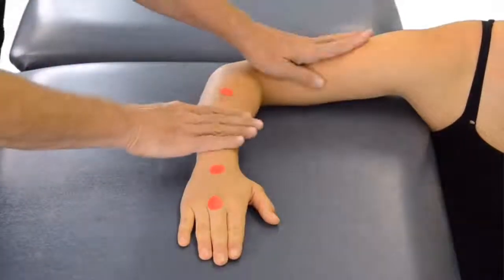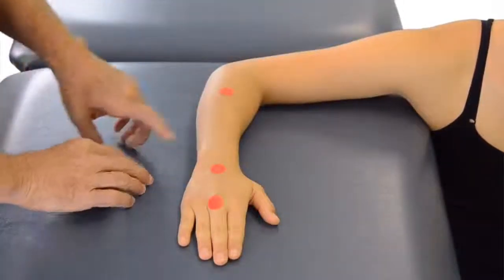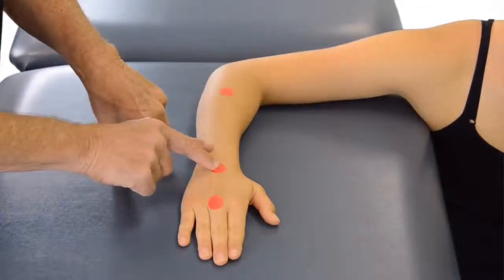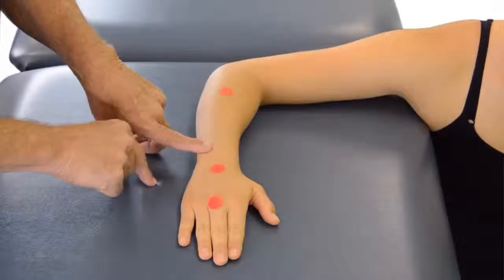In this position, with our patient sitting at the side of the table, we can now measure for radial deviation of the wrist. Our moving axis, in this case, will be directly over the capitate.